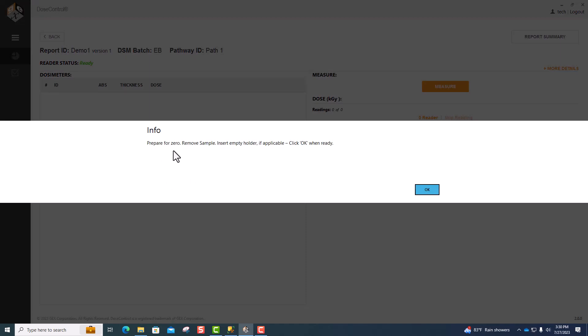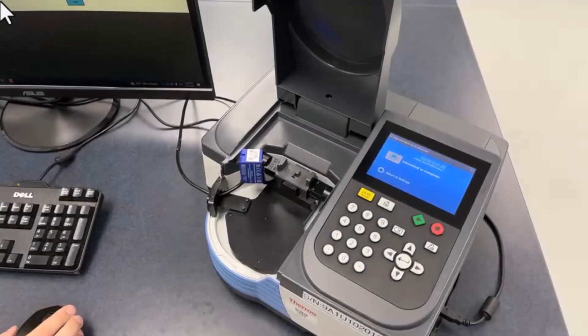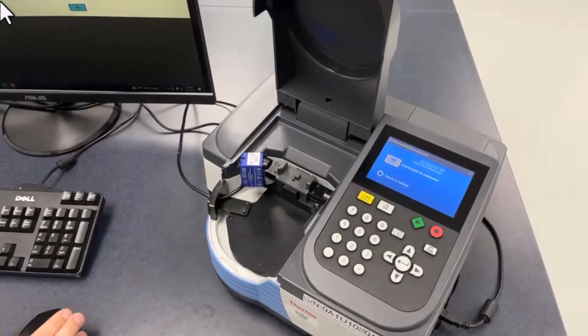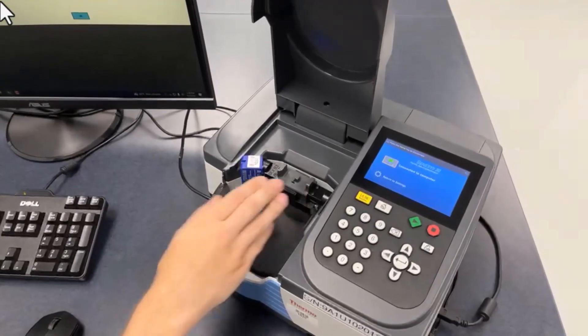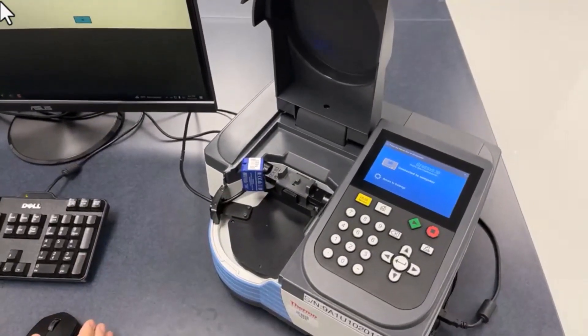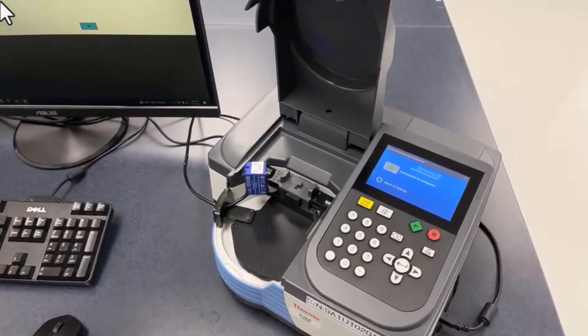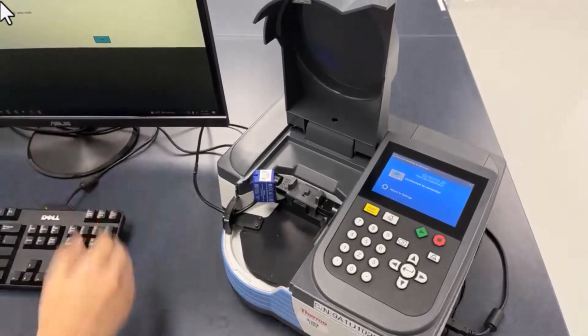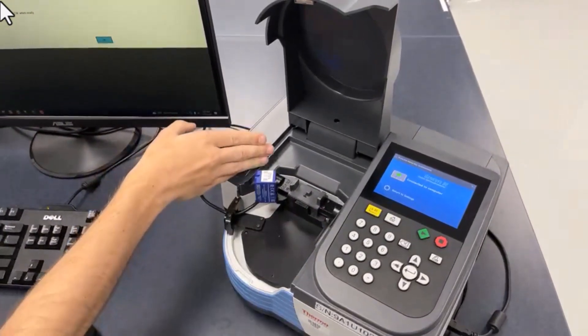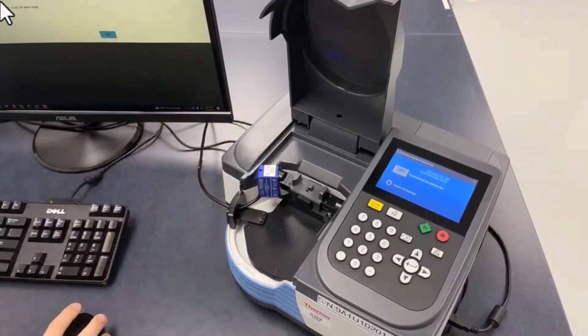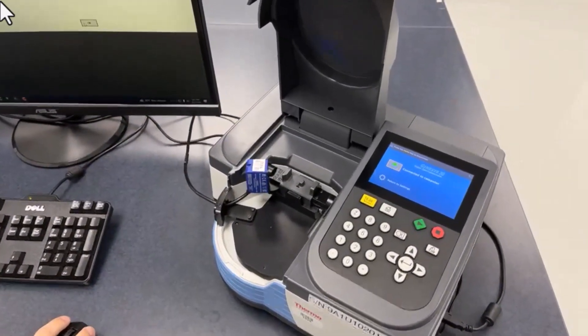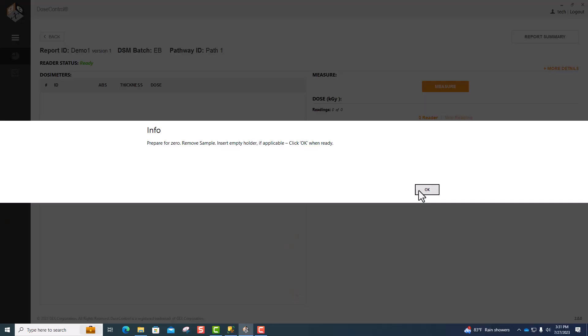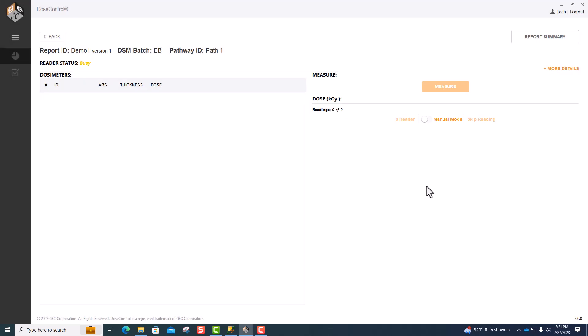The software will automatically zero the connected spectrophotometer. Make sure there's not a dosimeter in the holder, and this process can be completed with the lid of the machine open because the beam tubes help block out any unwanted light. Once it has been zeroed, you're ready to start measuring dosimeters.